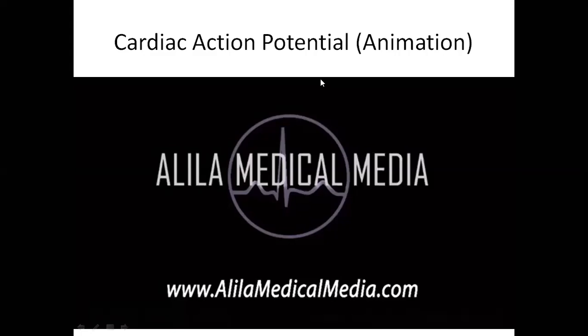Now, if someone is physically unfit regarding the heart, then this function will change. Change means the PQRST that was discussed in today's first video: there are timing gaps from P to Q, Q to R, R to S, S to T. So for a physically fit person, this will be the standard.